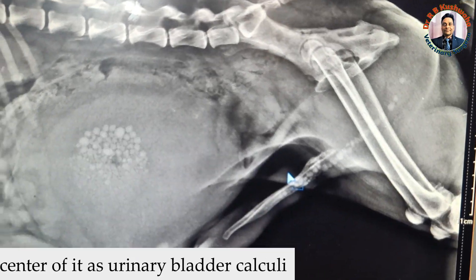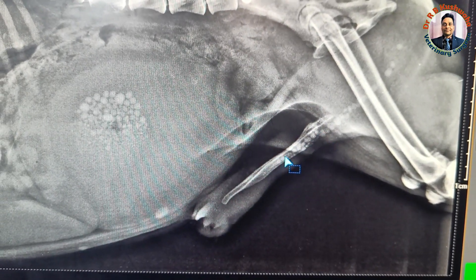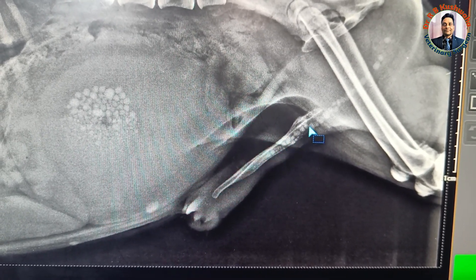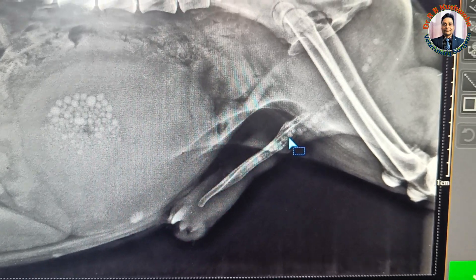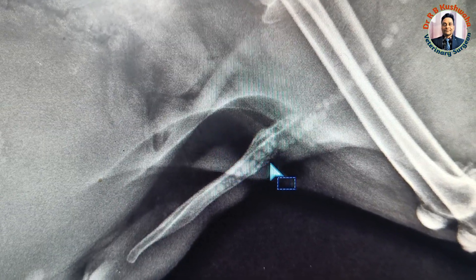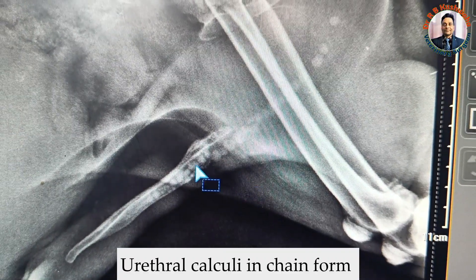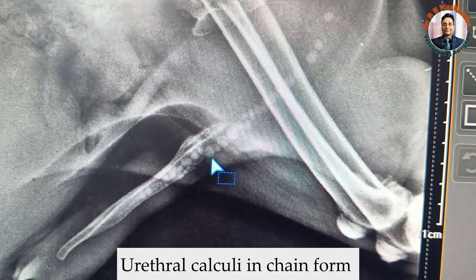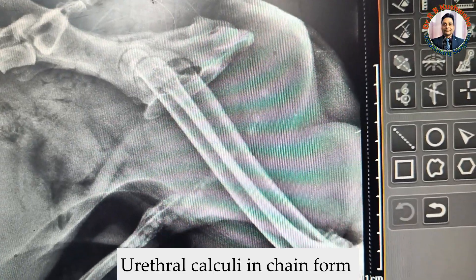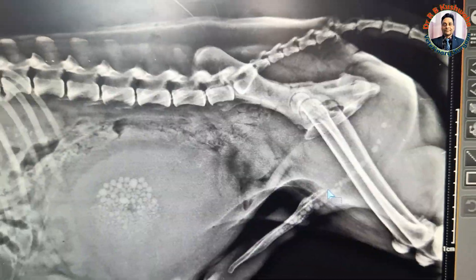If you look at the urethra, this is the os penis, and at the ventral surface of the os penis, the urethral groove is present, and in that groove the urethra runs. If you look carefully, you will find the same type of mineral density seen in the urinary bladder is also visible in the urethra — small mineral opacities in the urethra.